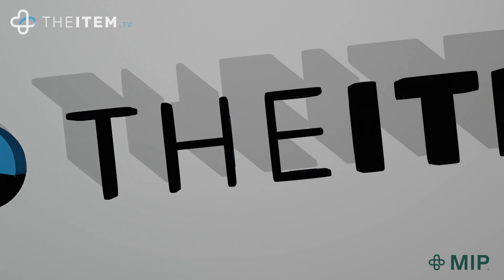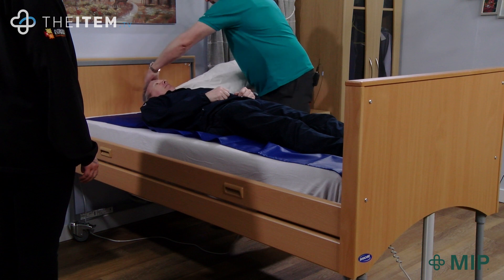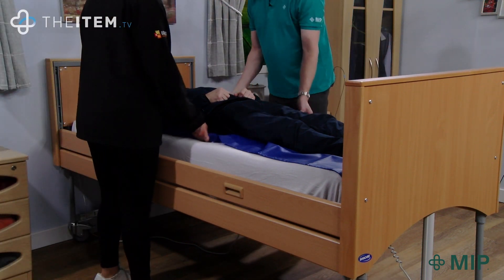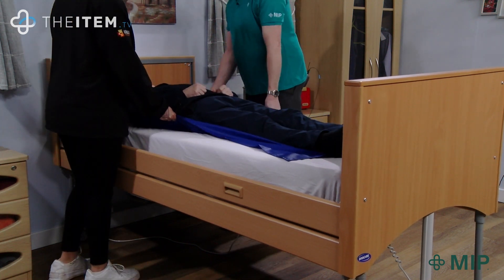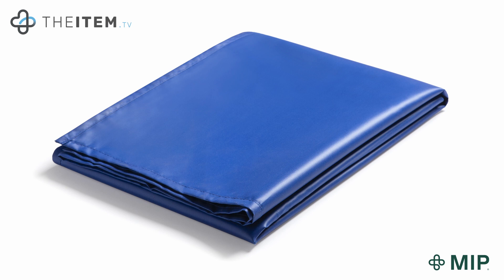Steve, thank you — let's see it in action. So that was the flat washable reusable slide sheet from Crompton's by MIP.